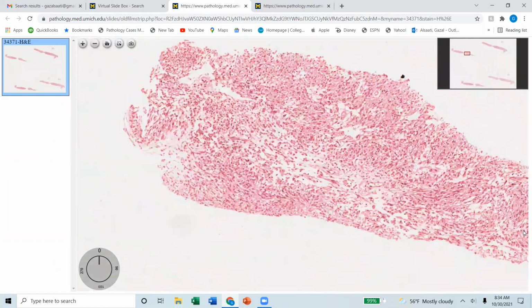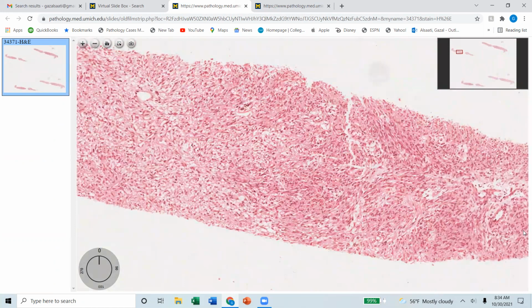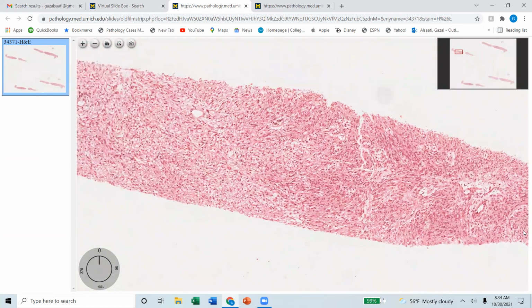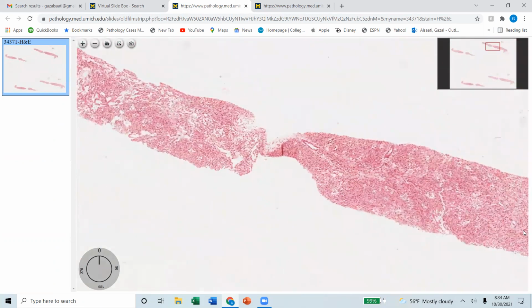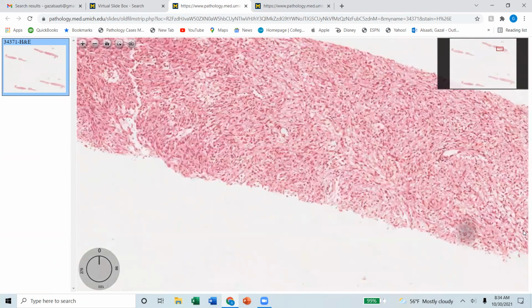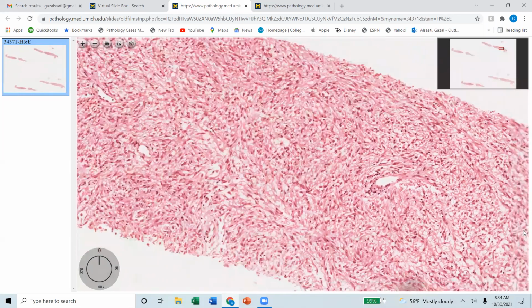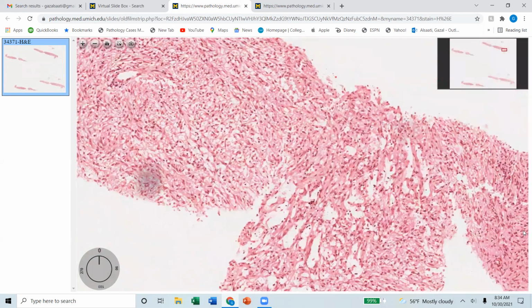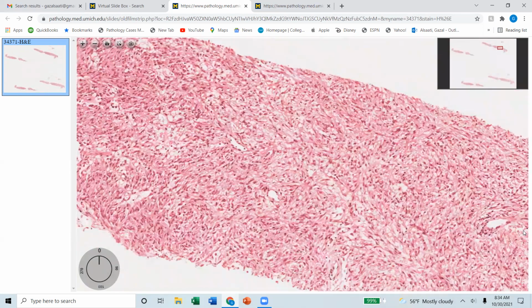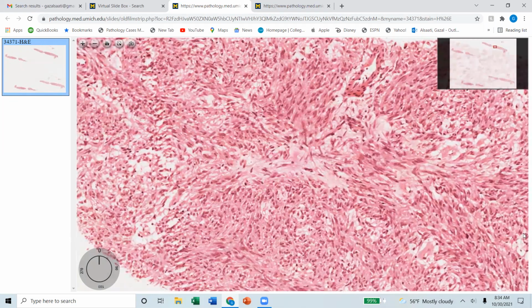Okay, makes sense, right? Almost looks like a core biopsy or FNB of a stromal tumor. Correct. And you have a spindle cell lesion. You'll just do your immunostains and tell them that you are looking at a core, and this may not be representative of the entire lesion because you don't have necrosis. It's just going to be a core biopsy diagnosis.